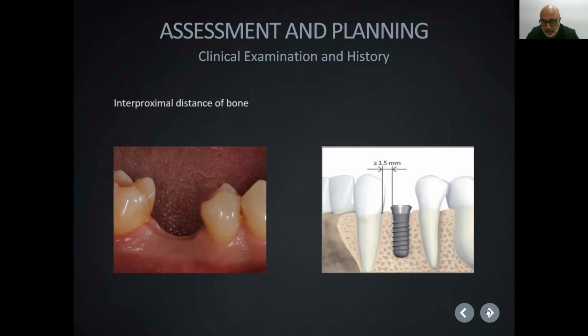I actually use their products and I like them. So that's why I talk about them. I have no real vested gain for doing that. I get nothing back. So if there are other things you want to use, please obviously do. There are thousands of companies and implants out there. But for this particular one, I would usually use a 4 mil diameter implant.